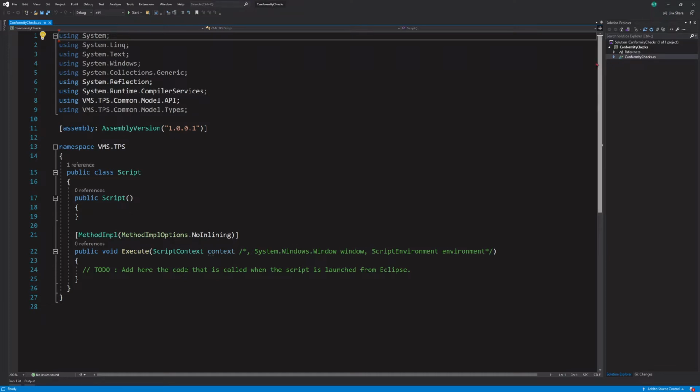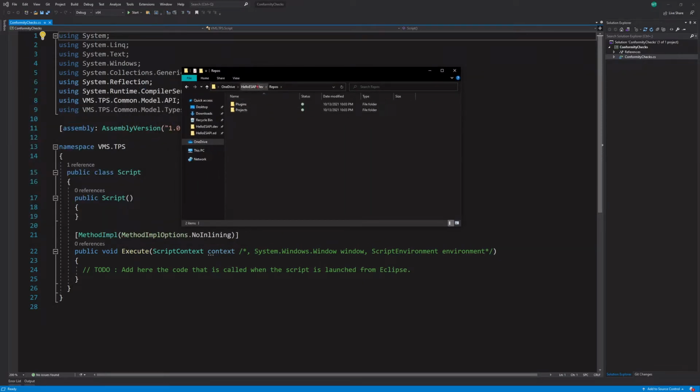So what we've done is we've created a single file plugin, and I'll just go over it really quickly. Inside this repos folder, it created two folders, plugins and projects. And actually, I want to put these in another one. So let's call this one conformity checks. Okay, so this is that first project that we're going to work on.